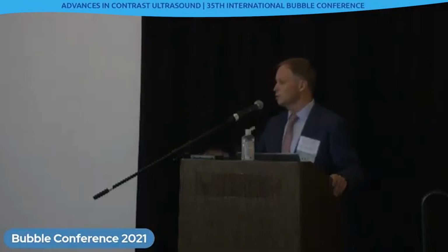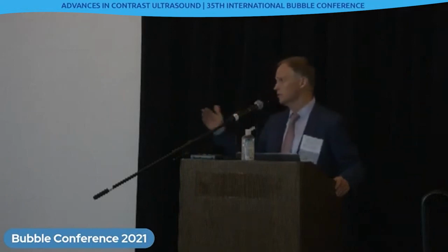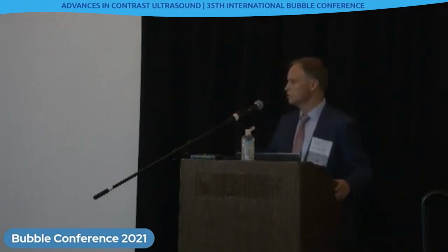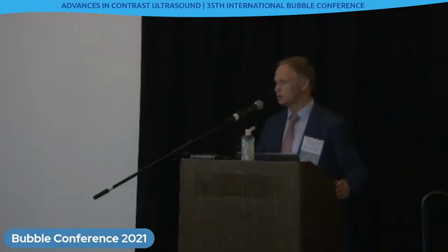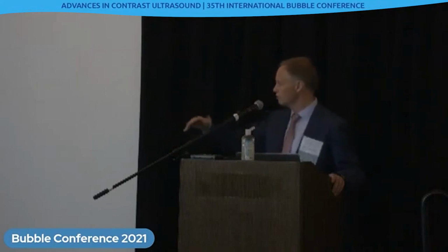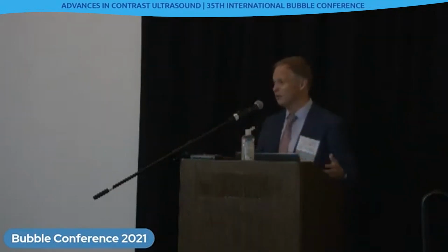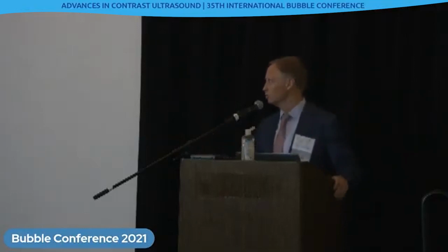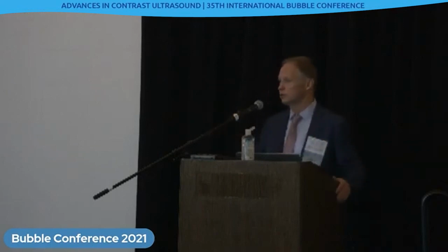Another reason to send all those patients to multidisciplinary conference, because even with LI-RADS 4 lesions, if the patient is on the edge of transplant, they will treat it. So I think it's a bridge to multidisciplinary discussions and just providing hepatologists with enough information for them to make a diagnosis. I really don't want radiologists to drive treatment, to drive management of the patients, but this brings us to the table and we can communicate better than with our flowery language before, saying there is hyperenhancement and mild washout. They don't know what that is. Now with classifications, it's easier to talk to them because they know 1 to 5.